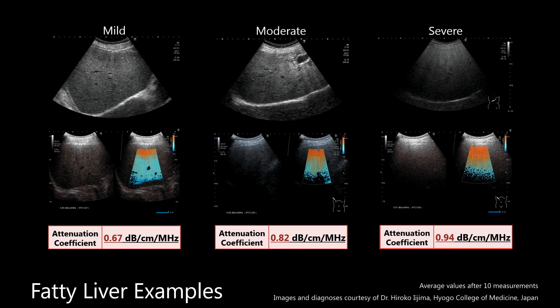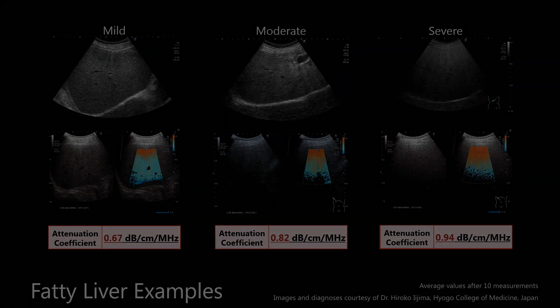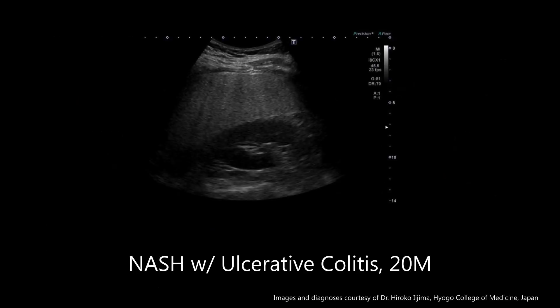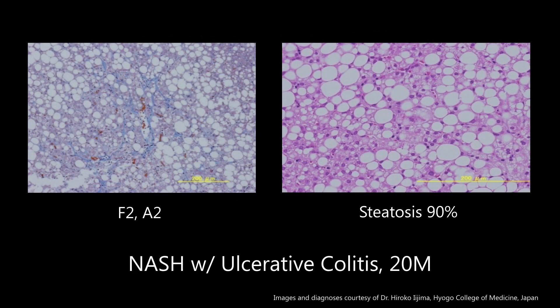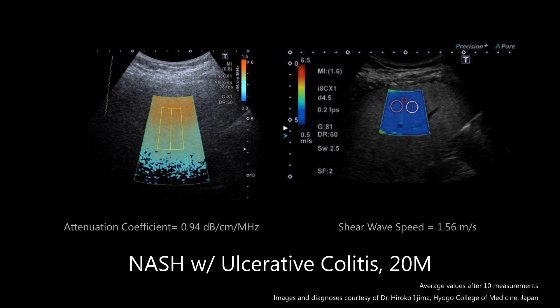Here are examples of how attenuation coefficient increases with liver fat content in cases of mild, moderate, and severe steatosis. This is a man in his early 20s diagnosed with non-alcoholic steatohepatitis, or NASH, and ulcerative colitis, showing fatty liver on qualitative ultrasound. Histopathological examination following liver biopsy demonstrated F2 stage fibrosis and A2 grade inflammation, indicating significant fibrosis and moderate inflammatory activity. Fat content was scored at 90%, indicating severe steatosis. Quantitative ultrasound assessment using attenuation imaging and shear wave elastography show consistent findings.